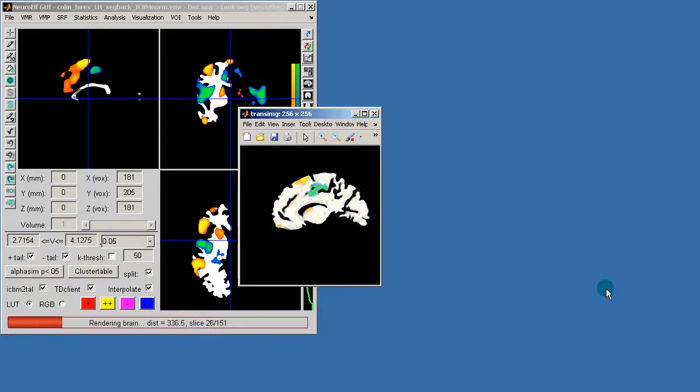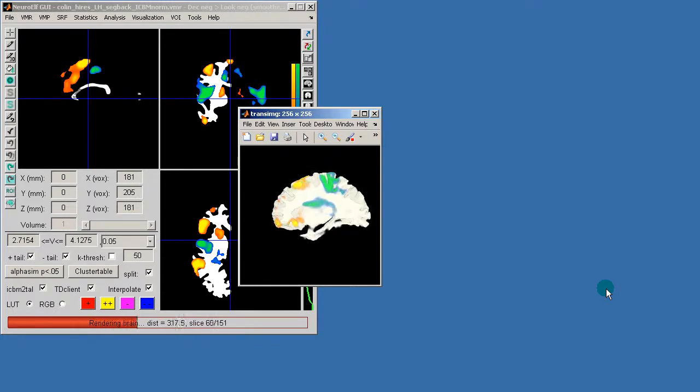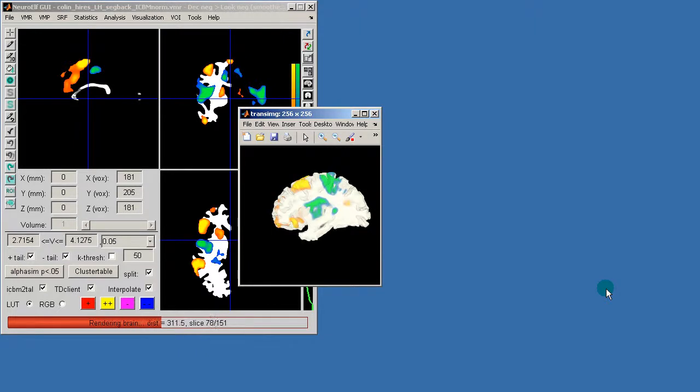And while this is rendering you can actually see the slices that it kind of creates to produce the final result.